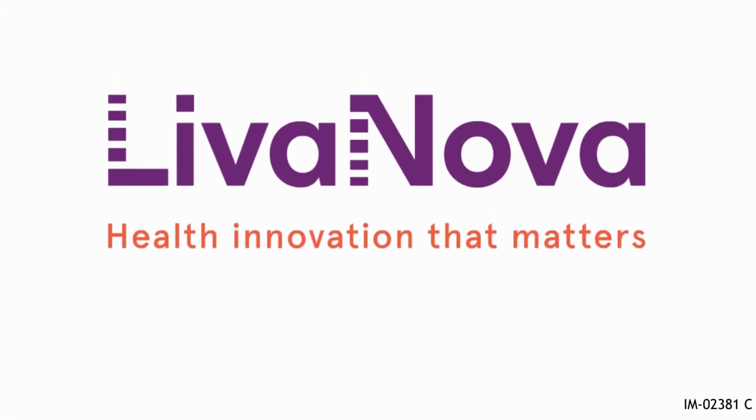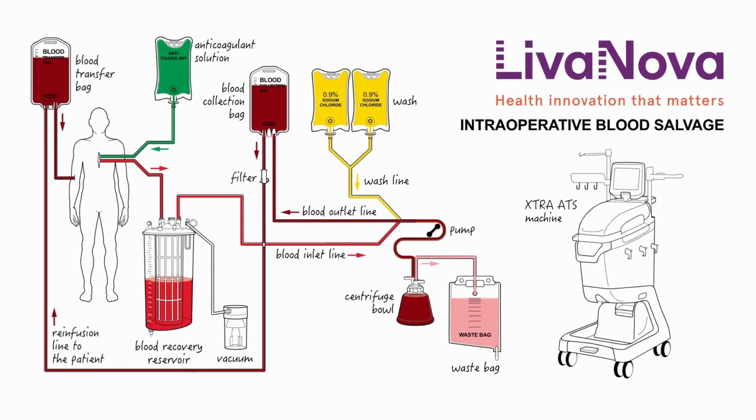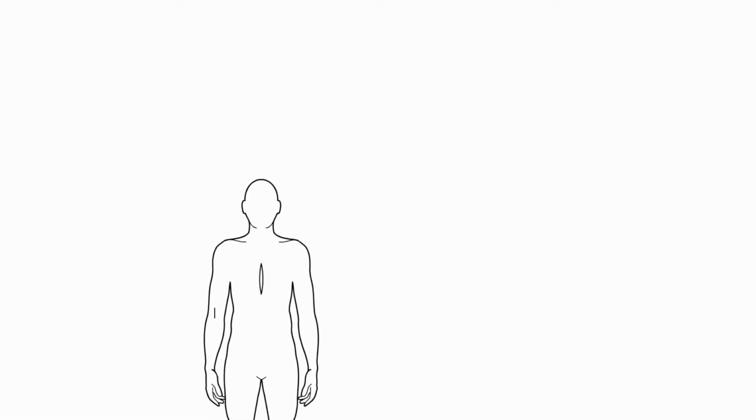Many patients routinely benefit from blood recovery during surgery as an alternative to allogeneic or banked blood transfusions. Several manufacturers make autotransfusion systems that are used for this purpose. Herein, we will describe the Xtra autotransfusion system.